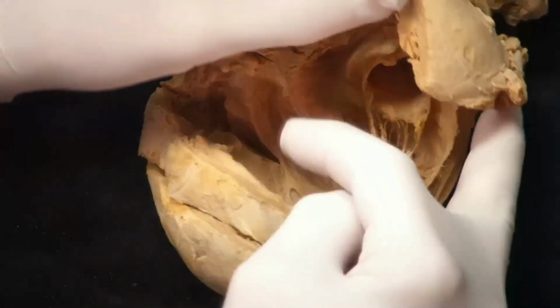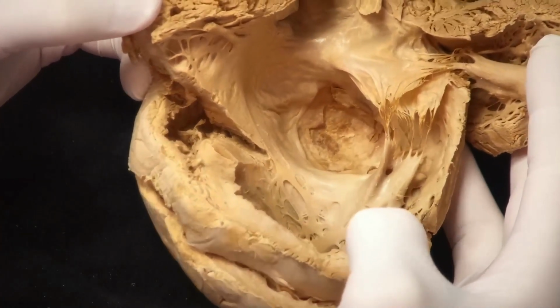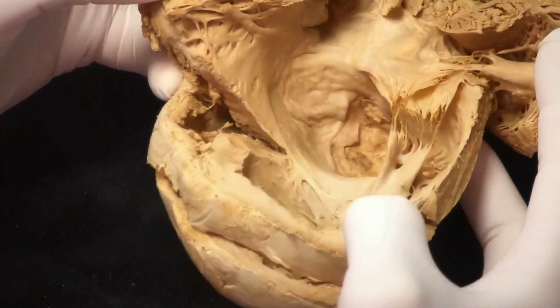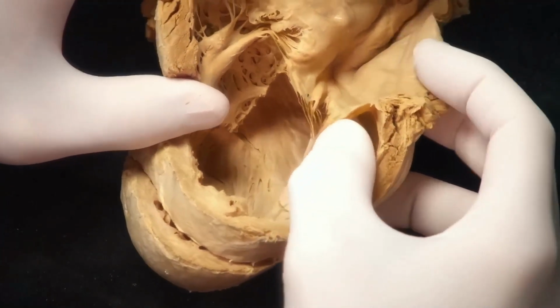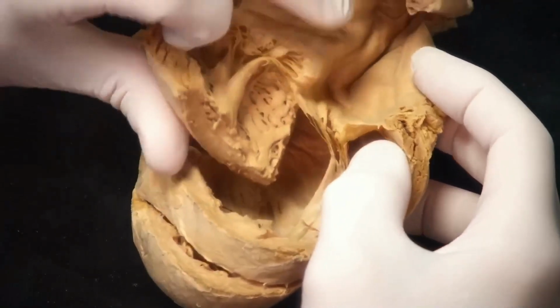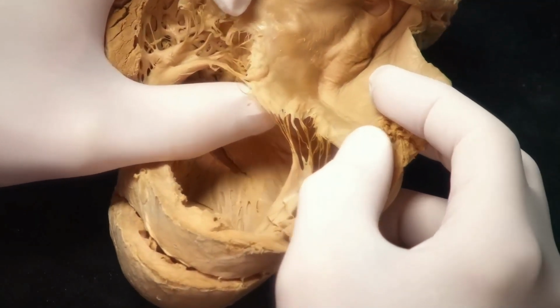If you look at this heart below, you can see that there's myocardial infarction with a thrombus filling that aneurysmal pouch there. And so you can get restricted motion for lots of different reasons, mitral annular calcification, for example. So what we need to consider is that the posterior leaflet is restricted.